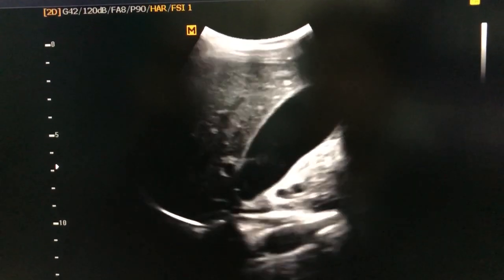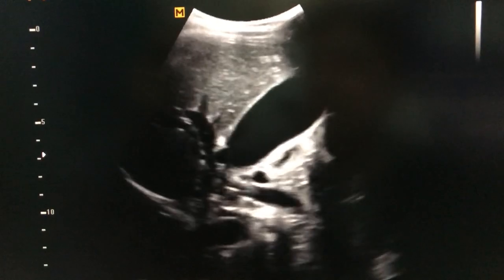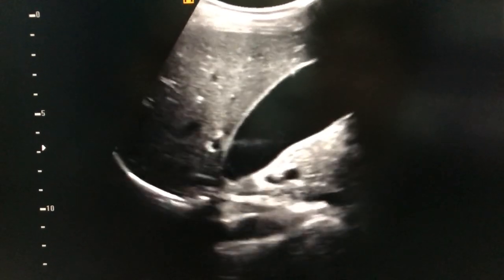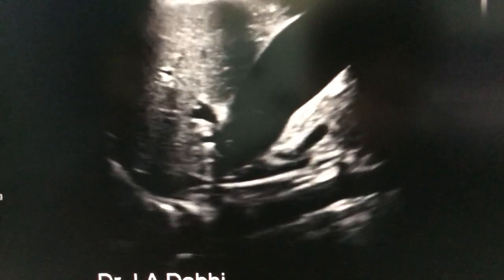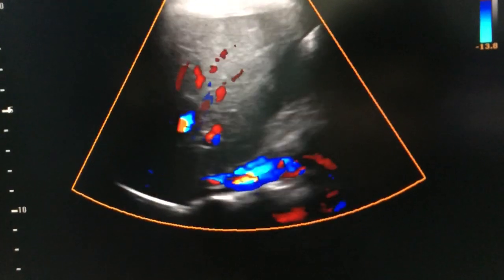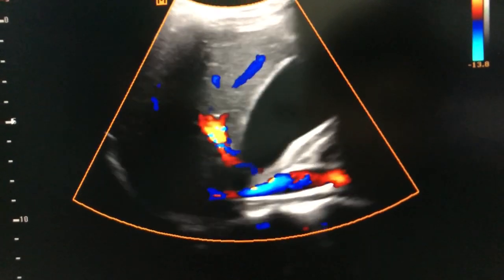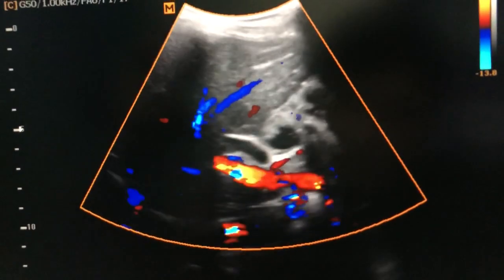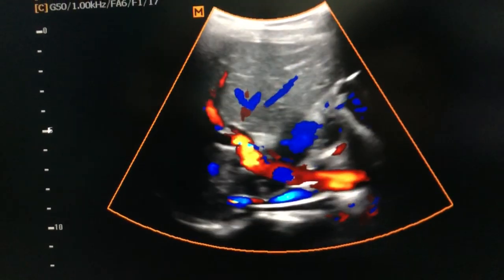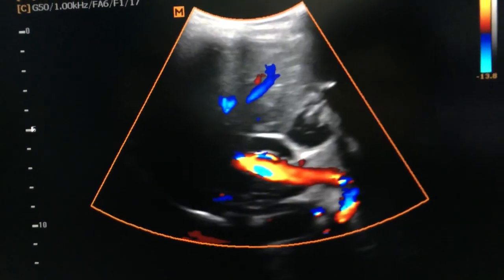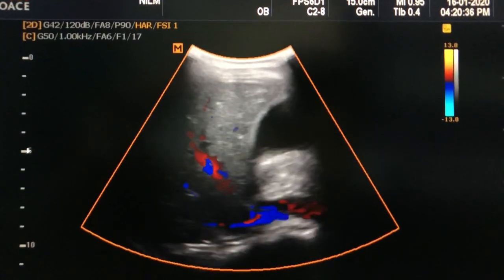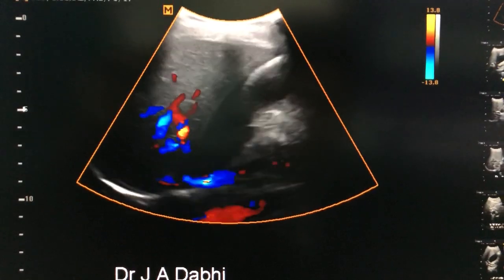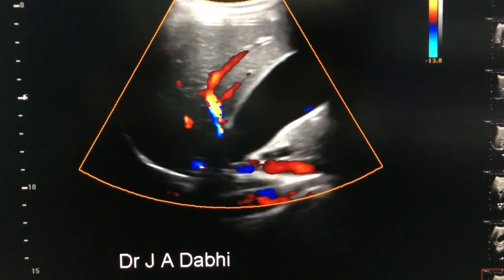This gallbladder is severely distended. We can see subjectively also that there is an over-distension. This is the common bile duct. The patient is having yellowish urine since 4 days.